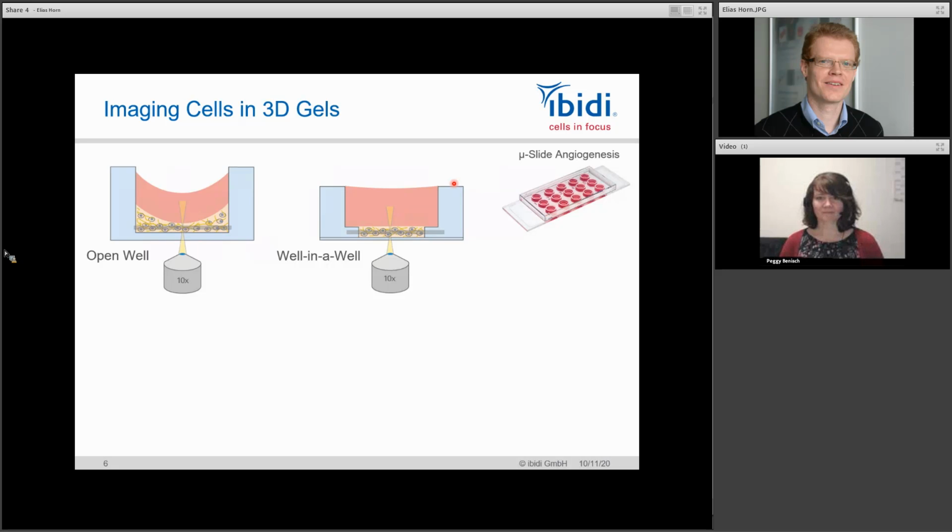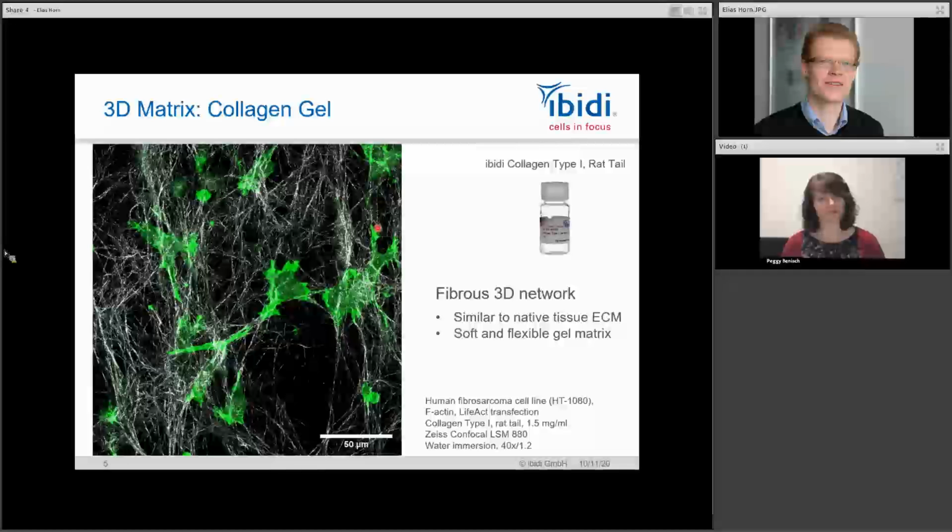And the gel itself is not like a solid block of gel. As you can see in the video here, the gel is 99% medium, and only the fibers are the gel matrix. Those solid fibers are the construct of the gel. Great. So if the gel is gone, the rest is medium. Yes, it's culture medium.